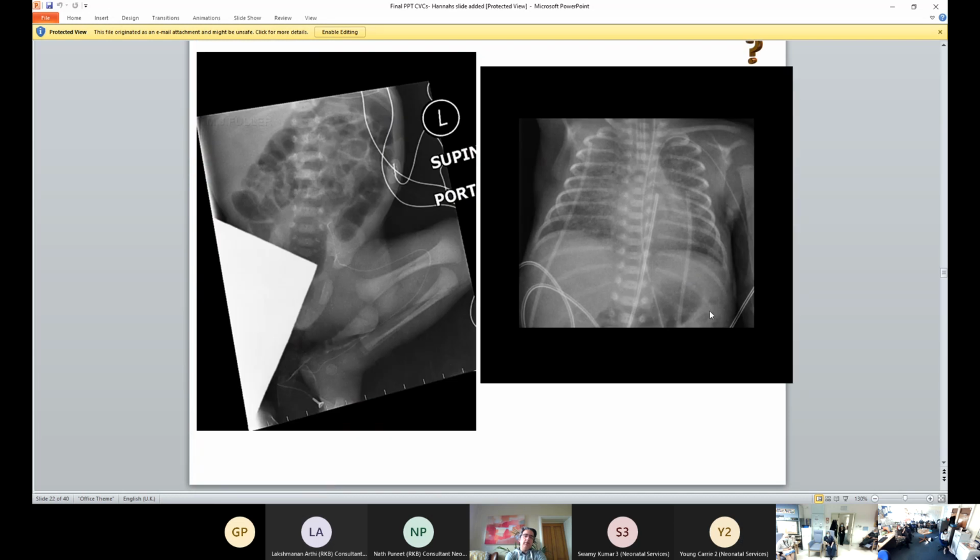So this X-ray on the right side, you see this long line going through the left side, as if it was going through the axillary, brachial, brachiocephalic, and then rather than crossing the midline to go to the superior vena cava, what happens here?